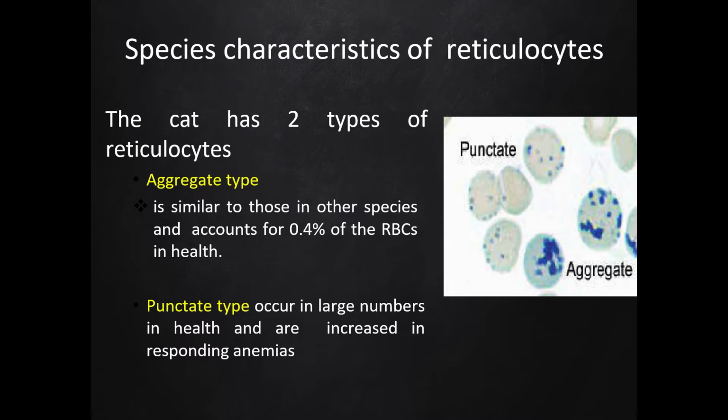Usually the punctate are cells having 2 to 6 small granules of reticulum, or a small pinpoint of reticulum.